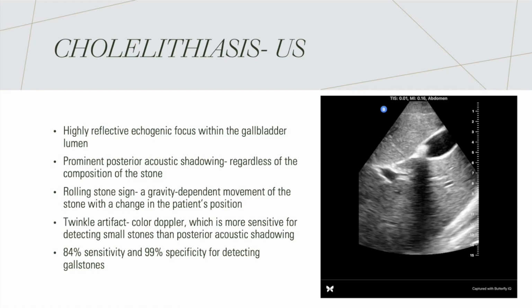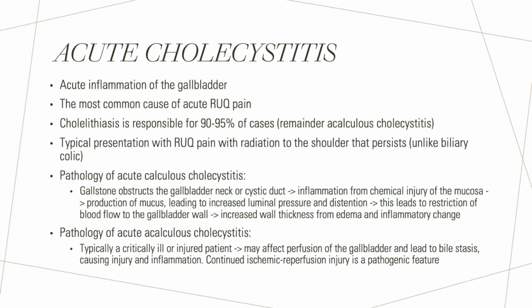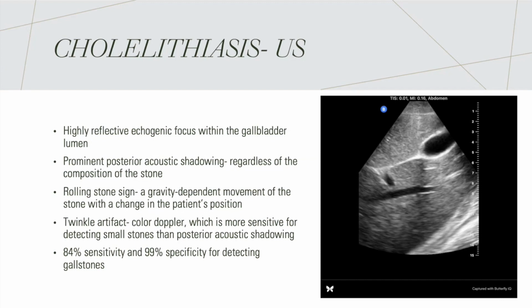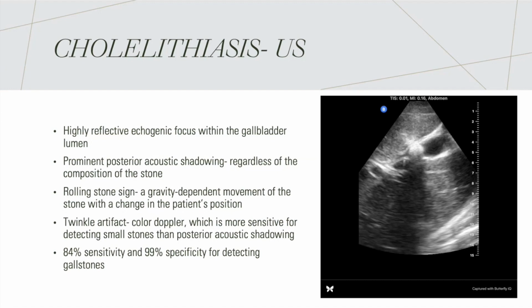So this is actually a video clip. Let me see it. I don't know if I'm going to be able to get it going here, but this is a video clip where you can also see the MLF coming into view, and you can see the portal triad. There we go. There we can see the MLF coming into view, and then you see the stone with the shadowing present.